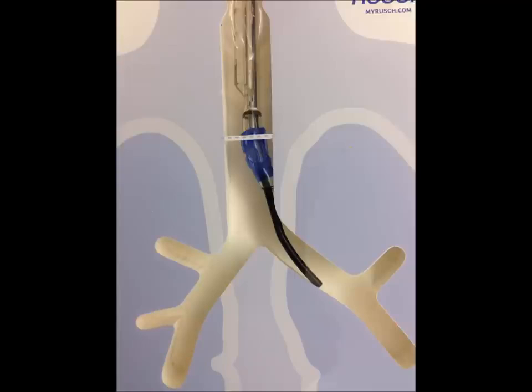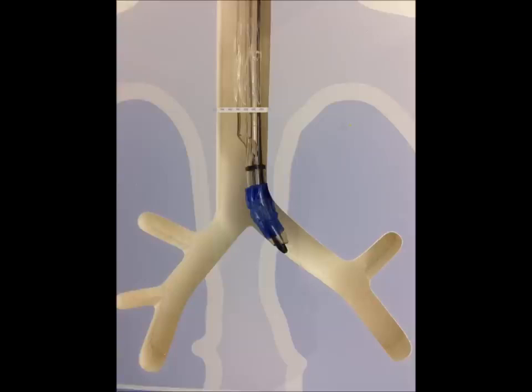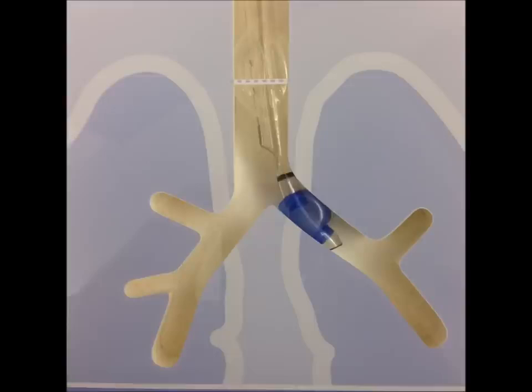When you see that, then you can thread your left endobronchial tube down the left side. If you advance the bronchoscope into the left side, then you can just thread it down. It almost always easily follows. Here you can see we actually have started to advance the tube, pull back the bronchoscope just a little bit, but be careful, because if you pull it back too far, you can cause the tube to go somewhere else. But anyway, this is a perfectly placed left endobronchial tube. It's right where it needs to be.